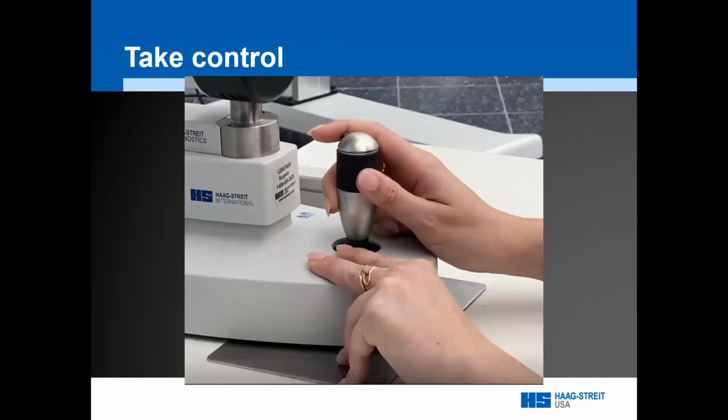Now, before we practice coaching the patient, I'd also like to suggest a basic handhold on the Lenstar that will help you have better control of the device. Here, if you notice, the dominant hand is on the joystick controls and the non-dominant hand on the base, with a finger also on the side and touching the table, and a thumb in the back, again touching the table, and the fingers acting like the tread of your tennis shoes to help maintain more control when adjusting the initial focus.